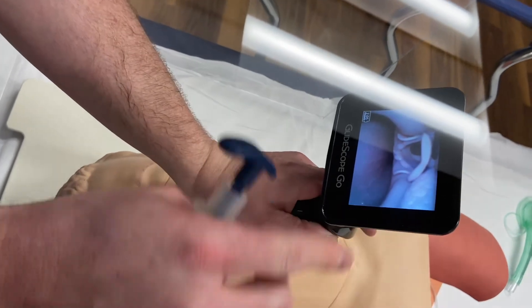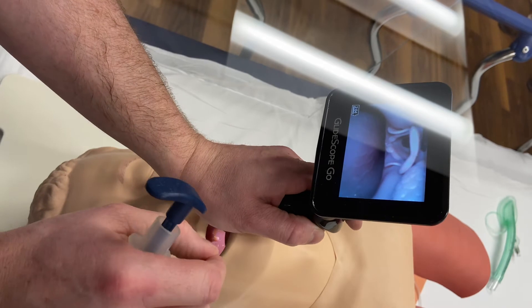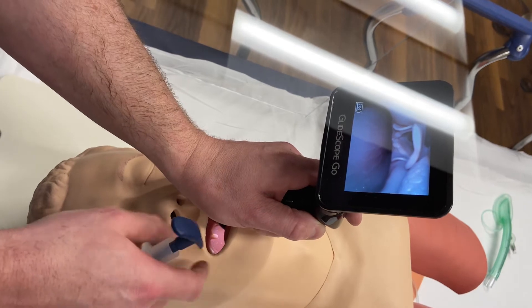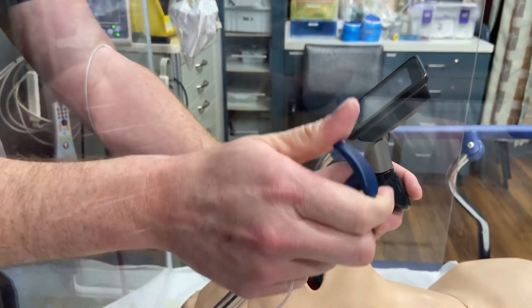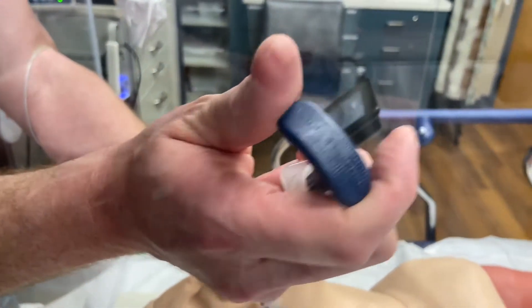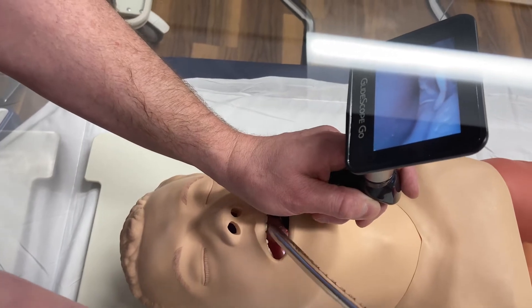This is a GlideScope Go, so I don't have to move my eyes too much, but with the regular GlideScope you'd be looking kind of to the left. Then you take your eyes off the cords — this is not what you do during regular direct laryngoscopy. You take your eyes off the cords and really focus your mind and eyes on putting the tube in the mouth. Always hold with your thumb on top, like a joystick grip, then take your eyes off the view. It sounds counterintuitive, but really focus on where you're putting the tip of the tube.